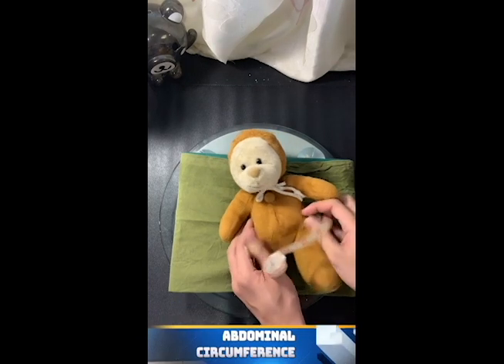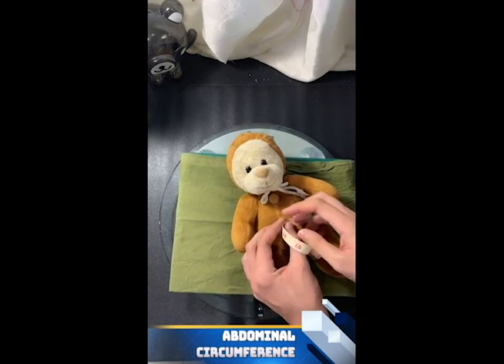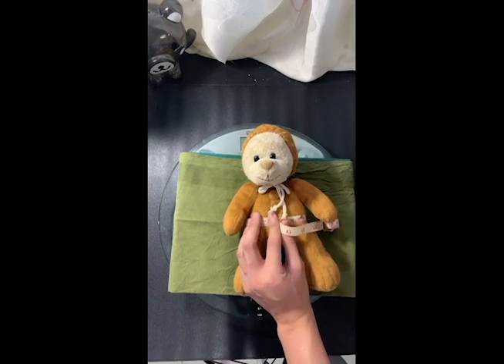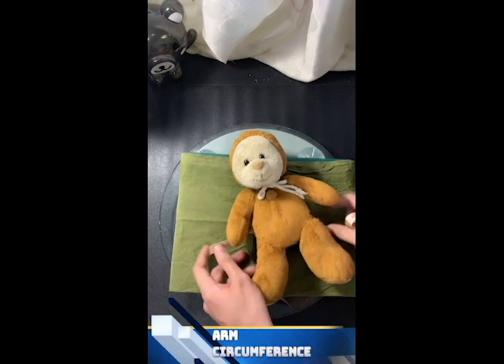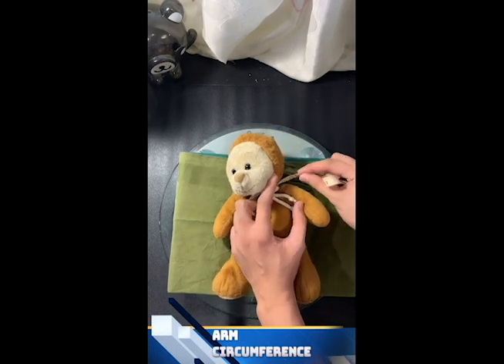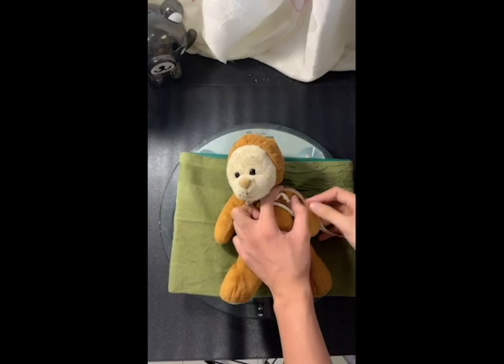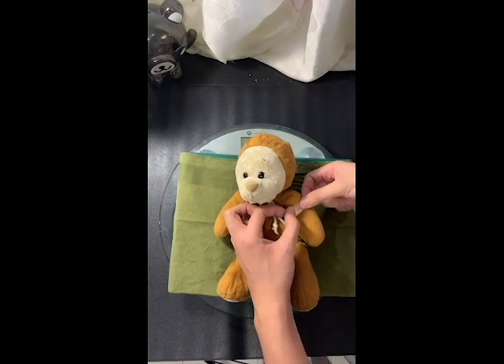Next is the abdominal circumference. Our landmark for the abdominal circumference is the navel. And lastly, the arm circumference, which is measured from the elbow to the acromion. Then mark the middle, and that should be our spot for the arm circumference.